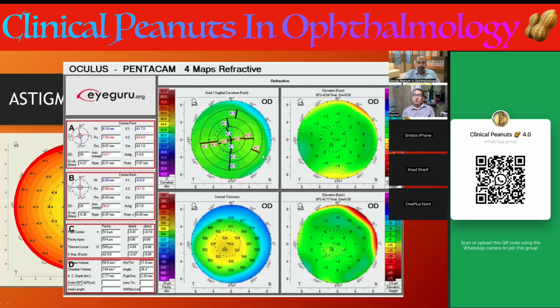So this residual power over the cornea, which is there in a significant number of patients, is being attended to along with the usual cataract surgery, and that surgery we call toric surgery, toric IOL, or cataract surgery with toric IOL. So nothing special. The only thing is astigmatism is a vector, so it has both components, the magnitude as well as direction.